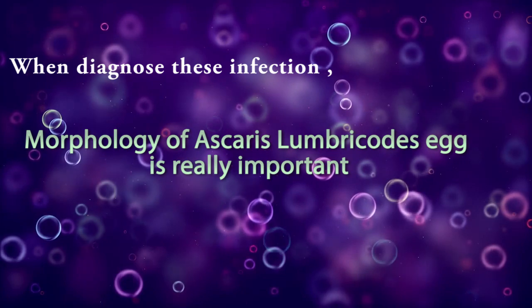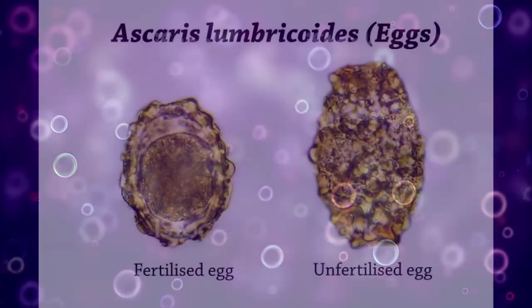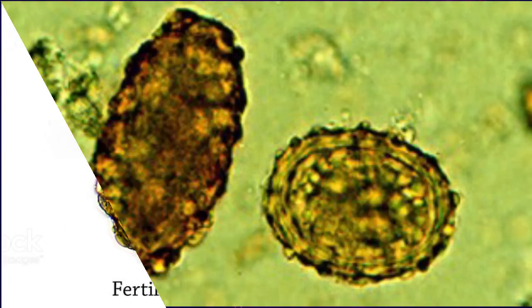When diagnosing this infection, the morphology of the Ascaris lumbricoides egg is really important. Fertilized and unfertilized Ascaris lumbricoides eggs are passed in the stool of the infected host.